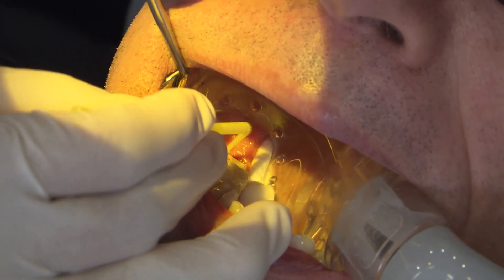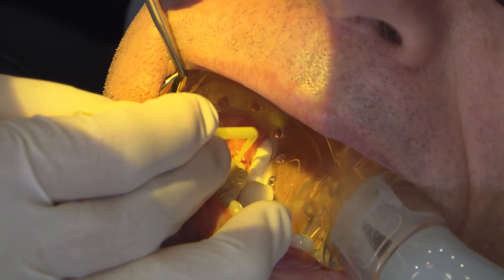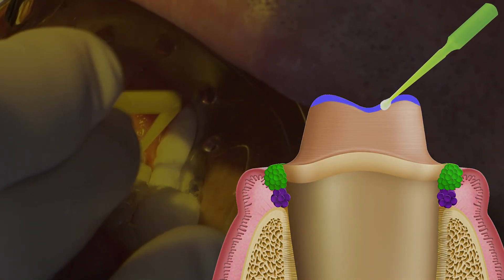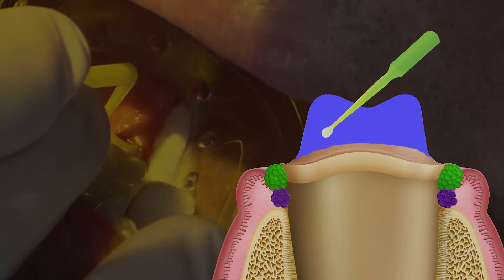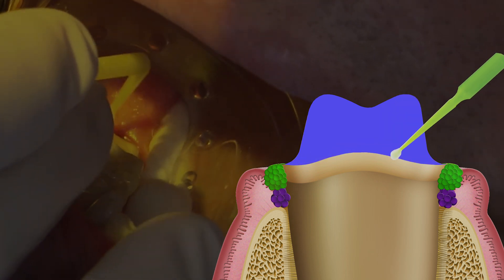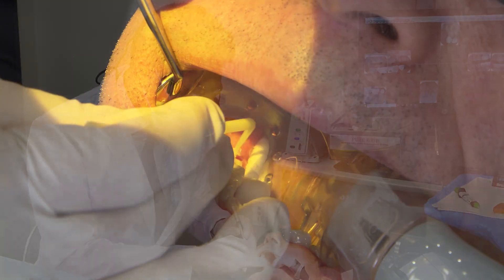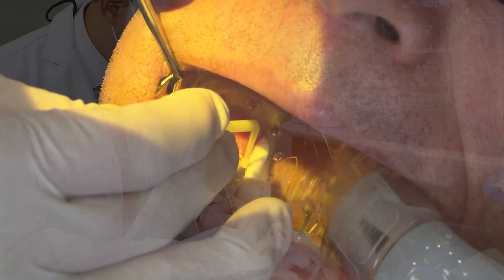Apply the microbrush — or however you're applying the bonding agent — to all of the exposed surfaces. I normally finish with the margin. So I start off on the occlusal surface and begin working my way down the axial surfaces of the prep. The very last thing I try to touch will be the margin, because you may potentially contaminate the microbrush by touching some of the surrounding soft tissue, especially if there's heme, saliva, or crevicular fluid in those areas.